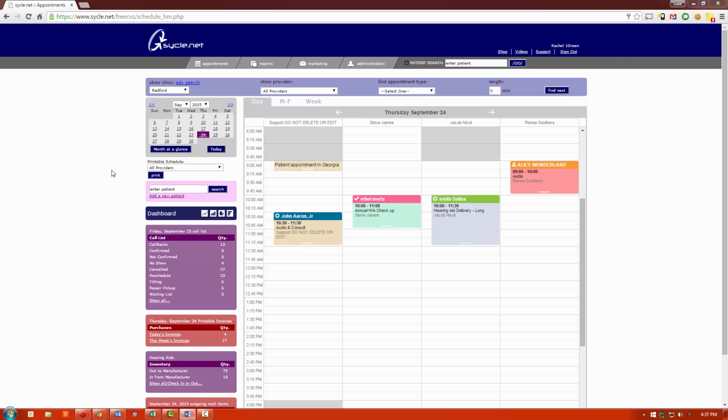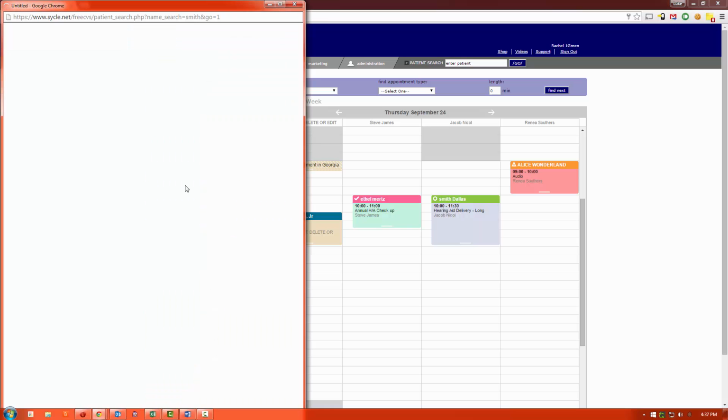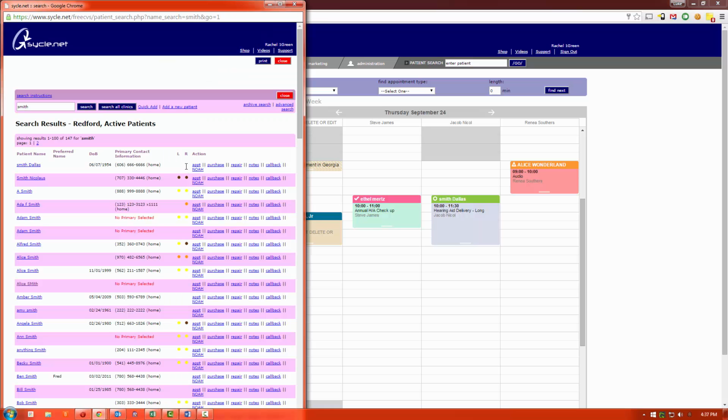One more thing to note, there are some pretty advanced features that have been developed within Sycle for special circumstances, the most important of which is the ability to reallocate or remove a NOAH session from a user when it was put there accidentally. There have been times where a user gets ahead of themselves and forgets what step he's at. He accidentally forgets to close out of Mr. Jones's NOAH data, and when Mr. Smith shows for his test, the user performs the test on Mr. Jones's profile accidentally. The user then needs the immediate ability to repair this error.